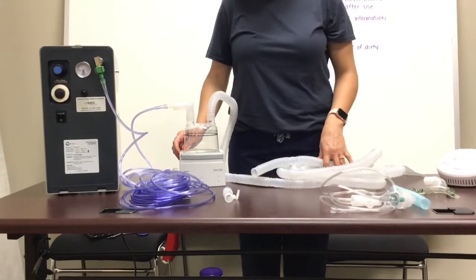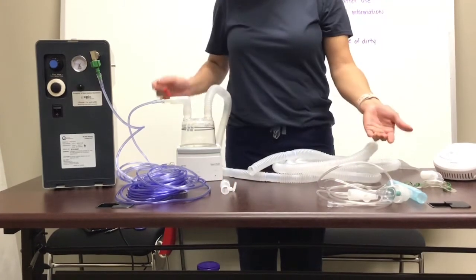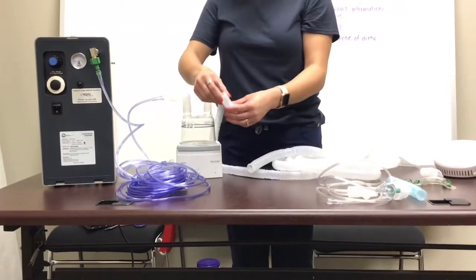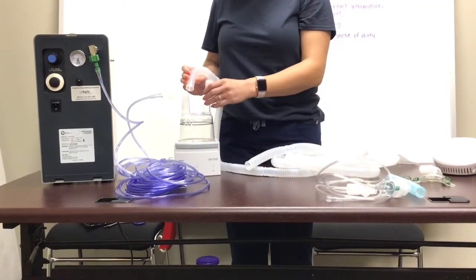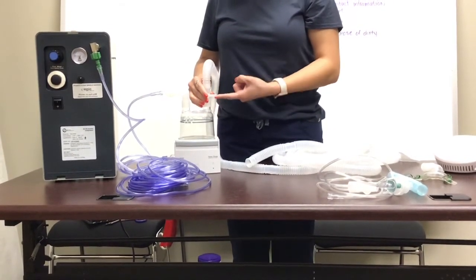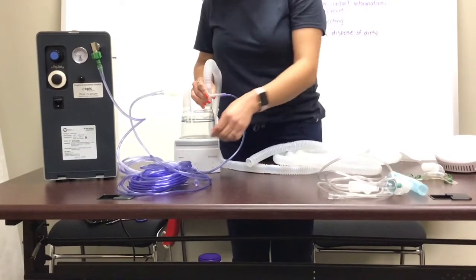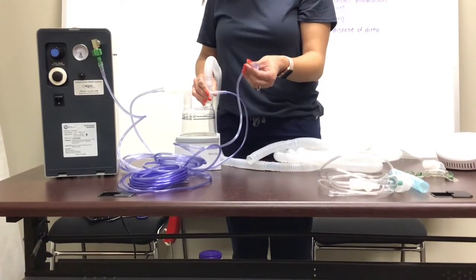This next clip will show you how to connect your oxygen if oxygen is needed, or connect your nebulizer treatment if nebulizer treatments are needed. First, you will be provided with a pressure line adapter. You will connect this adapter in between your corrugated tubing and your port of your water chamber, making sure it is tight and secure. Your pressure line adapter will have a small port sticking out where you will connect your oxygen tubing. The other end of your oxygen tubing will be connected to your home oxygen system or your concentrator.